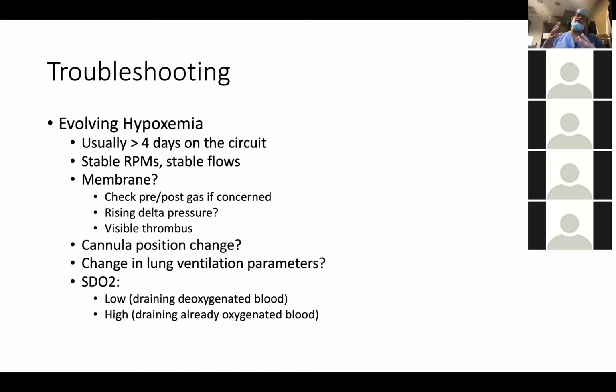These patients are on isolation. People are not vigorously scanning the oxygenator every 20 minutes like we might do up on Blake 8 or in normal situations. So people could be missing thrombus. The oxygenator is not 100% visible. 4 days is a little bit early for a thrombus if you're not having trouble with anticoagulation, but it's possible.